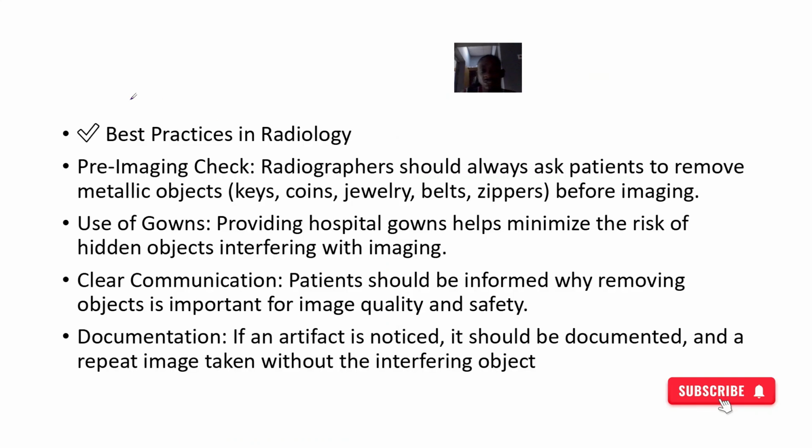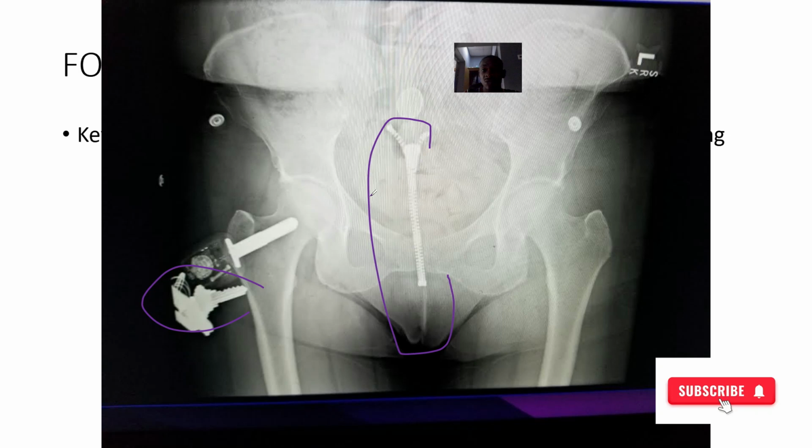Best practice in radiology is that before the imaging, you have to check the patient and make sure they don't have anything like keys, coins, jewelry, belts, or a zip on. Just like we saw in this image, you could see the zip there.